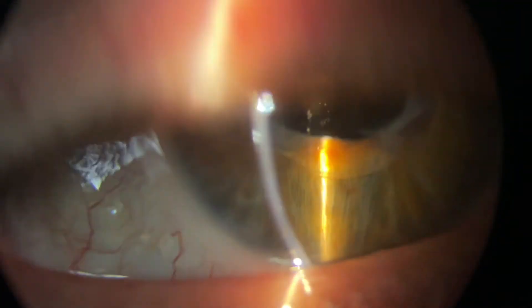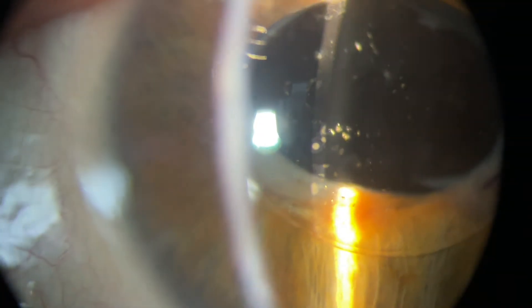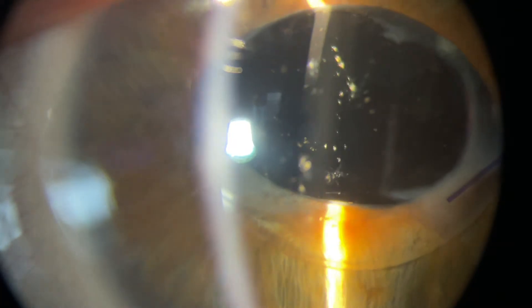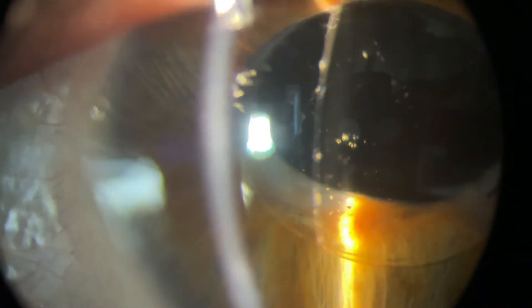You can see the implant, the inferior edge of the haptic — this has been like this pretty much since the original operation. It's not in the capsular bag; it's displaced in front of the iris. And if I just put on slightly higher magnification, hopefully you can see those giant cell deposits on the posterior surface of the implant.